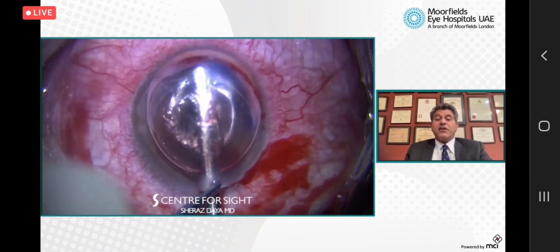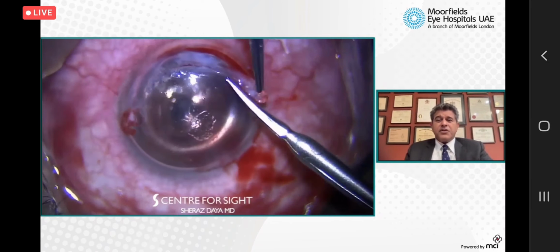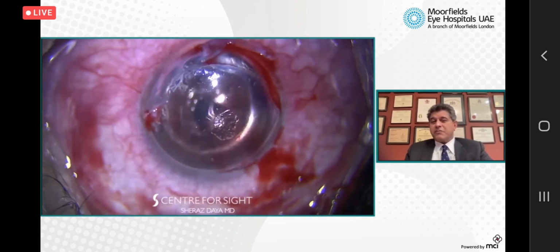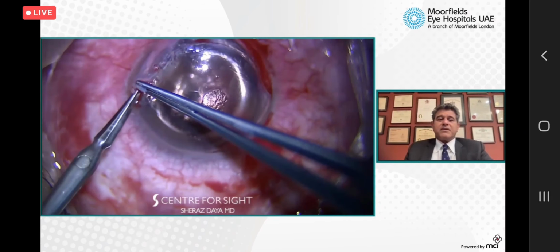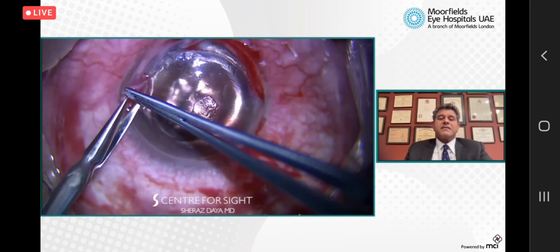And you can see I'm avoiding the area of recent hydrops. I'll leave that to the end. So here I'm removing this, and I'm pulling on that tissue because it does separate. Now, if that perforates, I'm not really bothered, because I'm going to be suturing that area up and invaginating that Descemet's membrane into the anterior chamber. So here, using Vannas to do some dissection. These are blunt-nosed Vannas scissors.